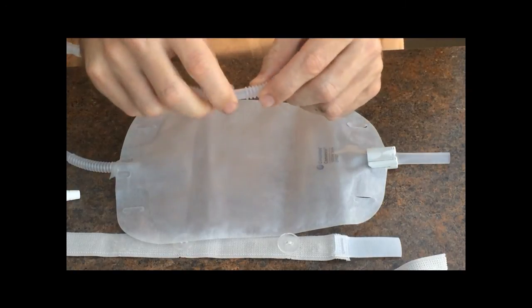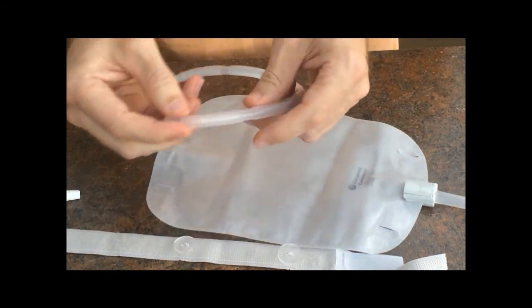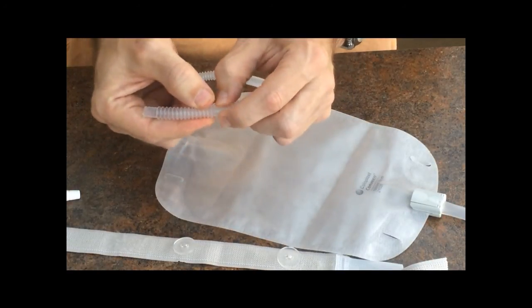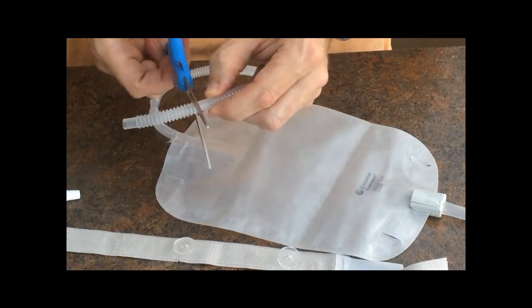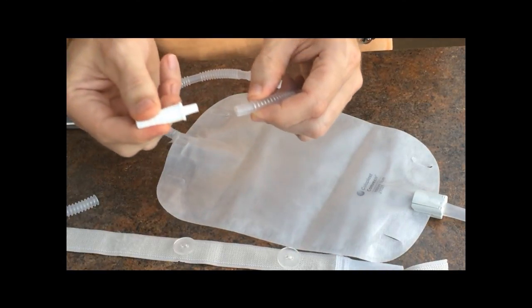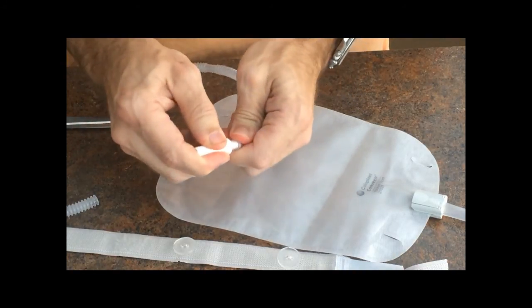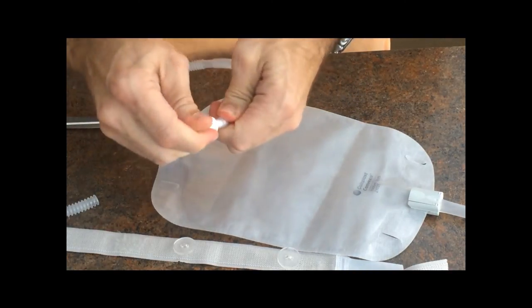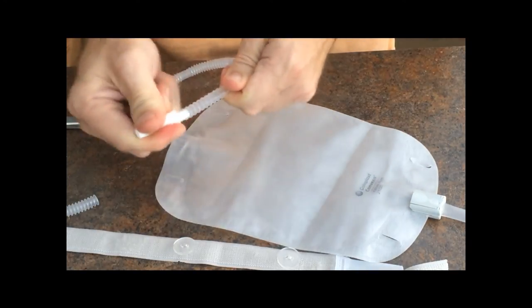As you can see here, there are baffled sections and smooth sections of the tubing. When you trim the tubing, it's important to leave the most smooth section as possible. So as you can see, when you do trim it, trim it right at the edge, leaving a smooth section here. This is where the connector plugs into, so you want to make sure that the connector is firmly fitted in there so there's no chance of it coming out. That's good and snug in there so it's not going to come out on its own.